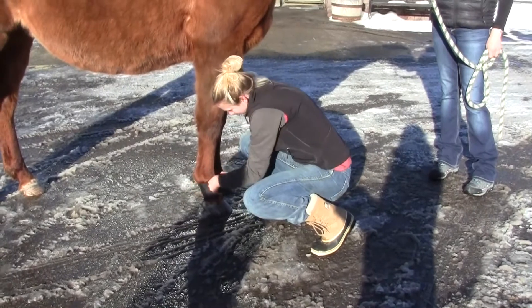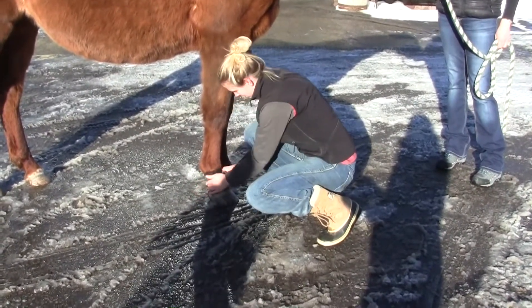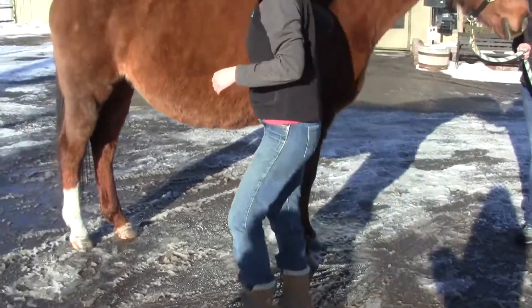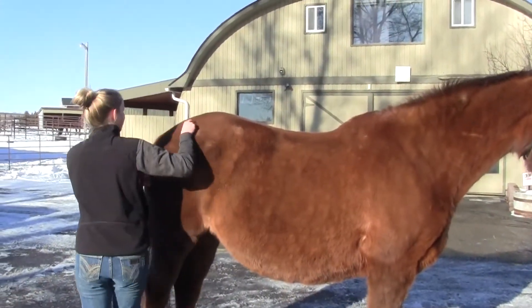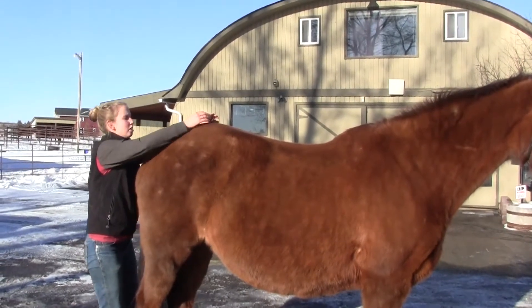In a perfectly sound horse, movement would be symmetrical from right to left. If there's any asymmetry, the Lameness Locator will measure and quantify it, giving us an objective measurement of lameness rather than just a subjective one.